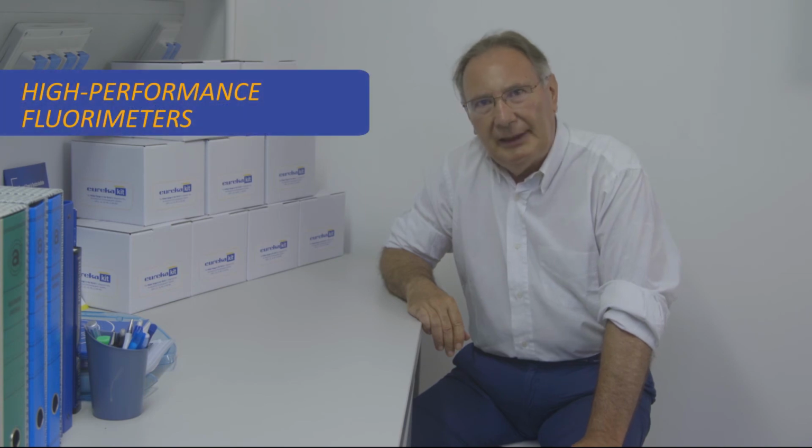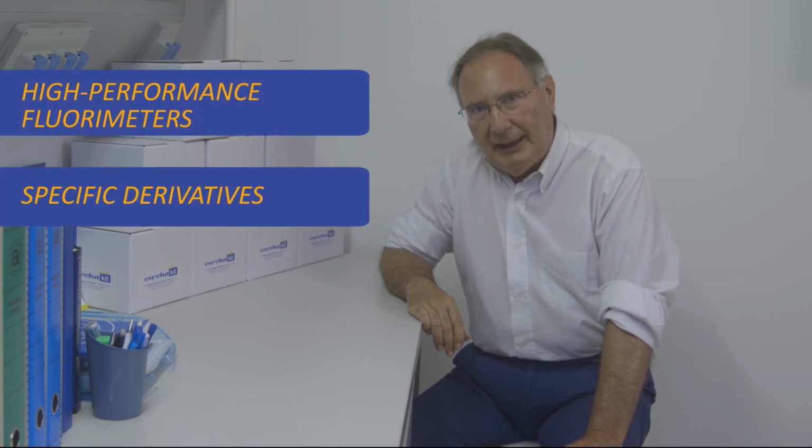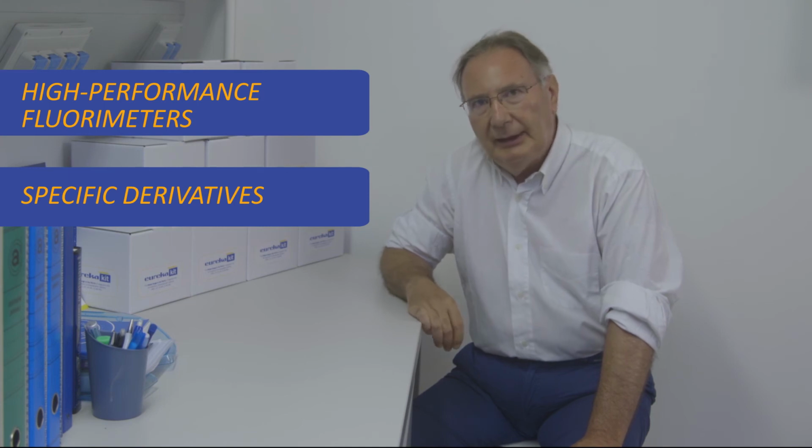Routine analysis doesn't afford us the luxury of having to find and deal with all the problems I've just described because of the inevitable loss of time. Therefore, the amperometric and coulometric detectors are, in my opinion, less suitable for day-to-day analysis. Fortunately, in recent years, high-performance fluorimeters and at the same time specific derivatives have been on the market, enabling the conversion from amperometric methods to fluorometric ones.